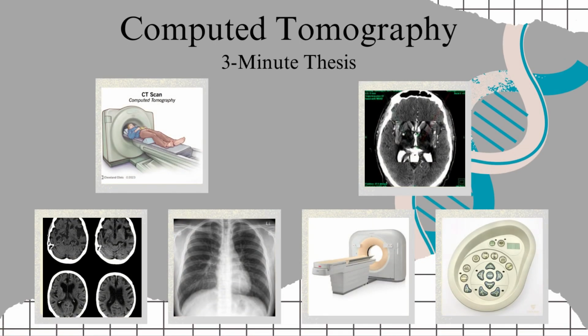Computed tomography, also known as CT scan or CAT scan, is a powerful medical imaging technique that provides detailed cross-sectional images of the body's internal structures. CT works on the principle of X-ray imaging. It uses a rotating X-ray machine and a computer to create detailed cross-sectional images of the body. Unlike traditional X-rays, which produce 2D images, CT scans generate 3D images.